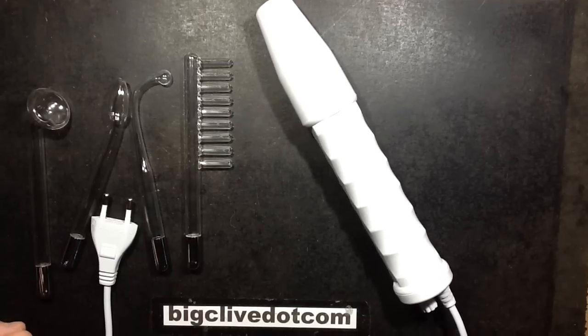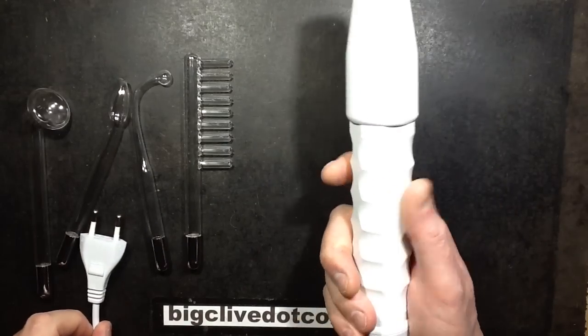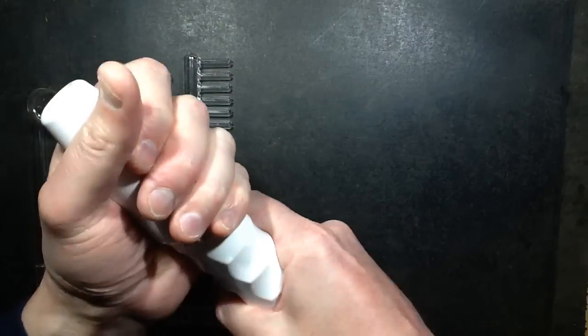But yeah, this one came from China, and I'm about to take it to bits to see what's inside it, because it's going to be nothing like the original units. So back to the world of light and better quality imagery. Here's the unit, and I have to say it's chunky, it's very stylish.